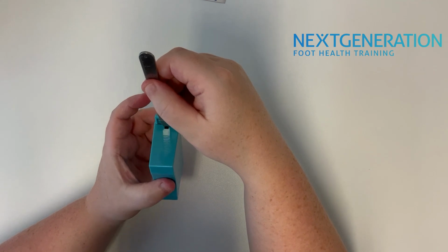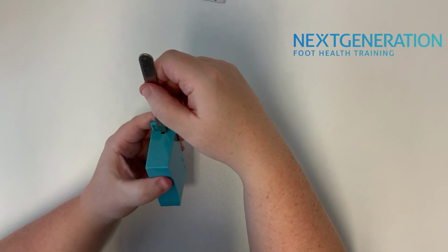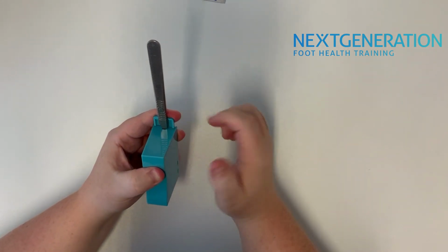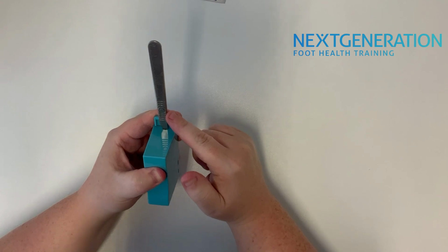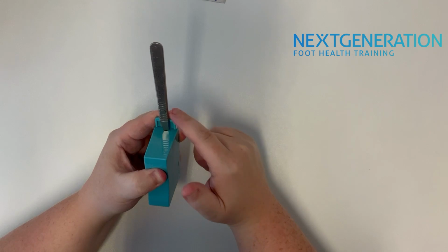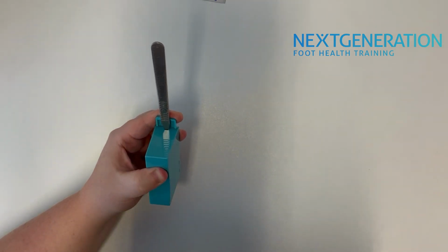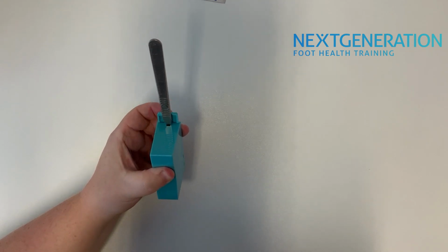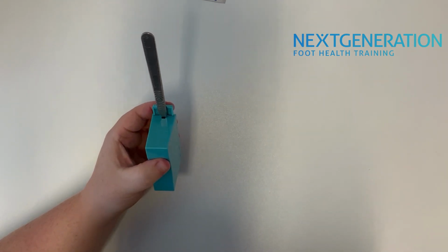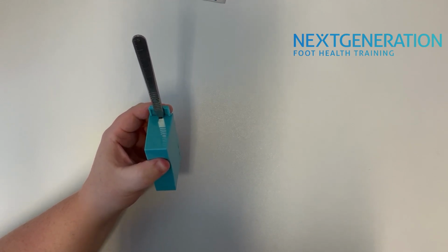Then we need to concentrate what we're going to do with our fingers now on top of the box, because we need a finger towards the end. But what I don't want to do is overexpose the flesh of my finger like that, because if I overexpose the flesh of my finger and that blade doesn't come off when I give it a pull, that blade could potentially cause an injury and wound to my finger. And if anyone's reading the manual on sharps, you'll find that most of the injuries occur to people that actually use the blades rather than injuring patients that we use them on. So what I want to do is just make sure I don't overexpose the skin on the finger there at the very end of it.